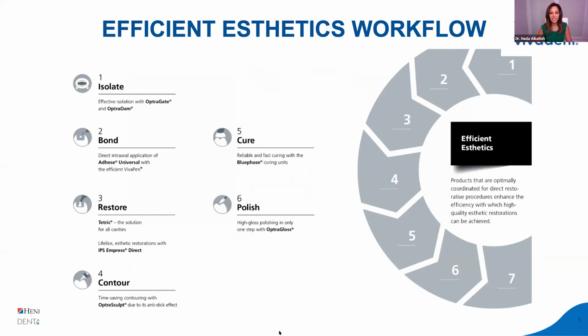And so there's really 6 steps to it. We'll break it down into 6 parts to make it really simple and easy to think about. After you've prepped, and I want to just take a moment and tell you something about prep.